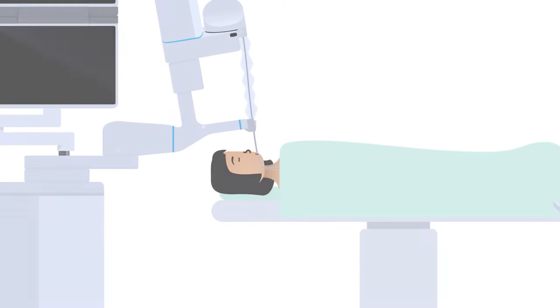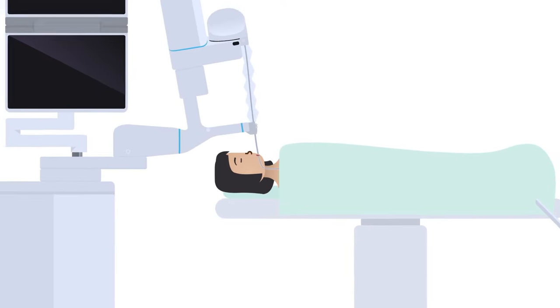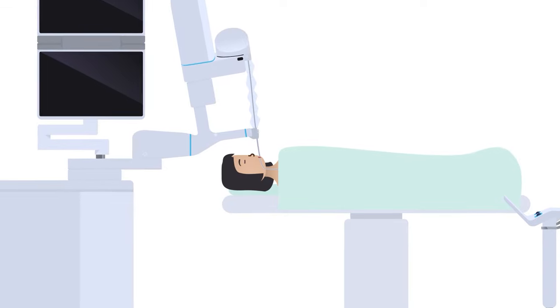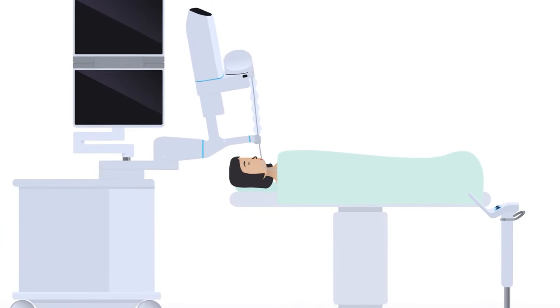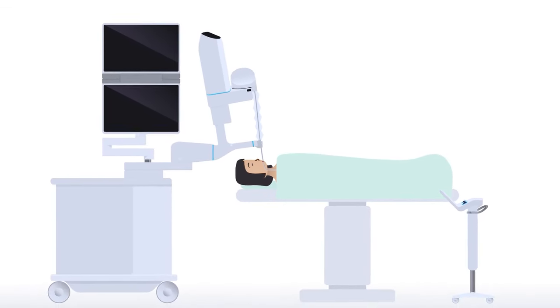To begin the procedure, the patient is placed in supine position. That means they are laying on their back and they are placed under general anesthesia.